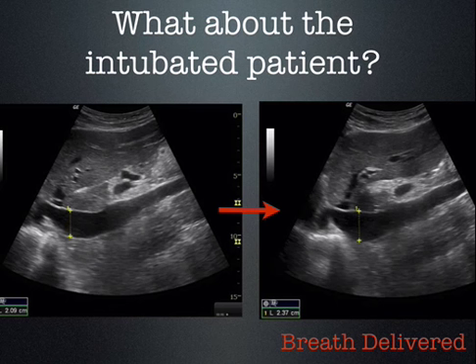We've not been able to clearly establish what diameter, or if a diameter, what percent diameter collapse correlates with fluid responsiveness. We give a fluid bolus, cardiac output increases. That's never really been parsed out in the literature on a spontaneously breathing patient. However, fluid tolerance is pretty well studied, i.e. we're going to give a fluid bolus and we're not going to hurt the patient. Some people often cite 50%. I like to go to about 30%. Okay? And this is just based over tons and tons of studies of the IVC. Patients do just fine if you keep going up to about 30%.